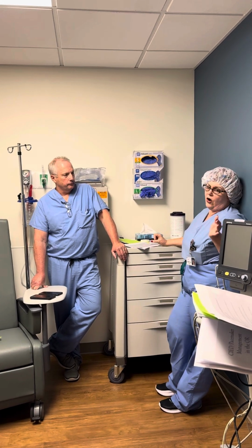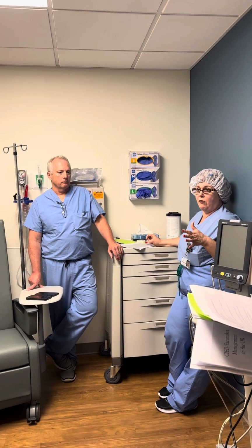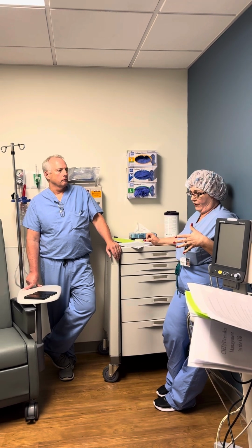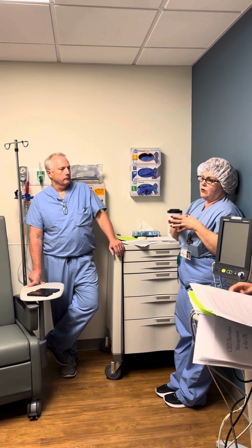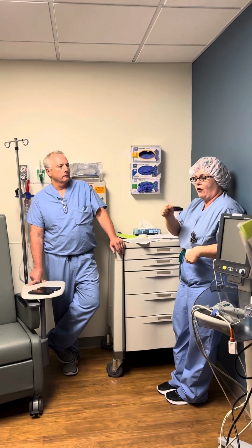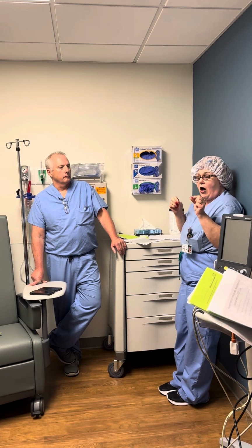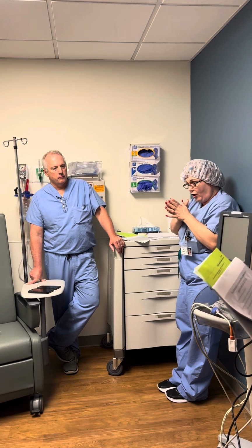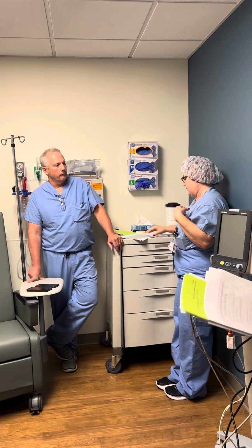We want to try and encourage them to use bipolar cautery if it's possible versus monopolar, since monopolar is going to tend to interfere with that electronic device. Use the lowest setting possible, and we also want to make sure that they're using short bursts. They can't just go in there and be cauterizing for long periods of time. When they're cauterizing, we need to look with anesthesia at the monitor to make sure the patient still has a rhythm. We don't want them to go into asystole because the device isn't functioning.